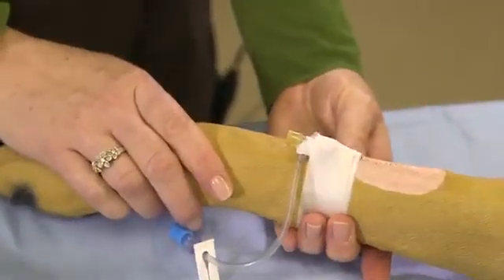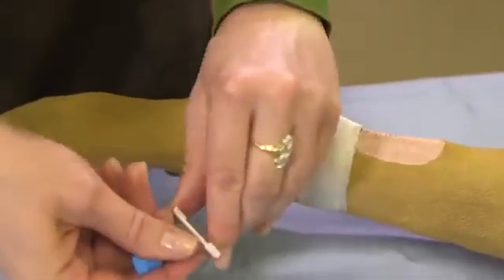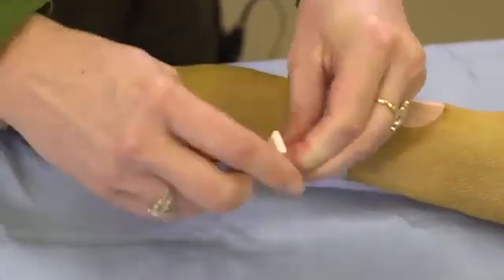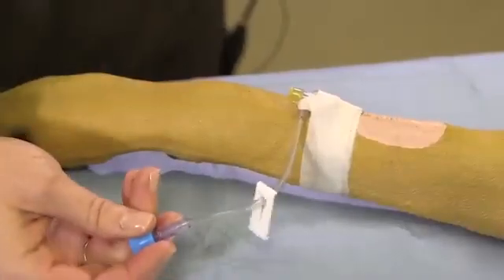That is your IV catheter with T-port. Then with this portion, you can use that in order to inject any drugs or fluids.